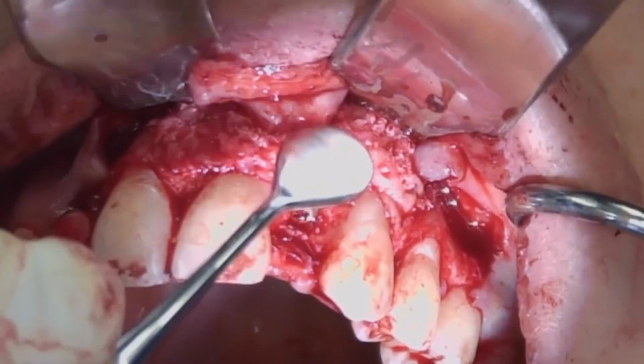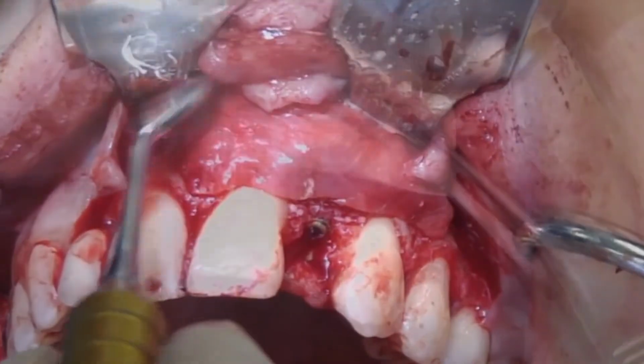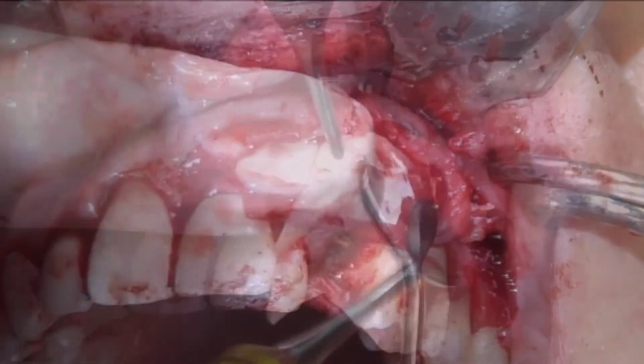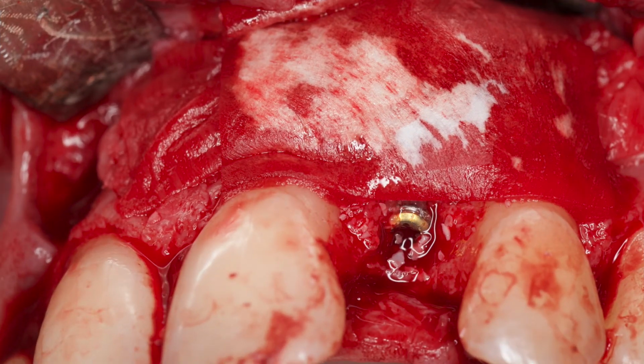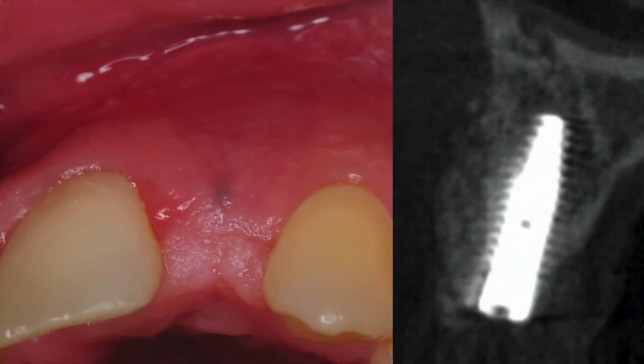So this is an opportunity for us to take some additional amount of bone. This is mixed with PRF, laid out on the buccal aspect. I also did an additional amount of micrograft material to really provide some more tissue support over the graft, just to thicken up the ridge. Both bone and soft tissue. Exactly. Long term. And then PRF, we close this and let this mature for about the next 4 months. Wow. So we have additional bone, which of course will go through some remodeling and shrinkage, but this will give us the outcome that we're looking for.